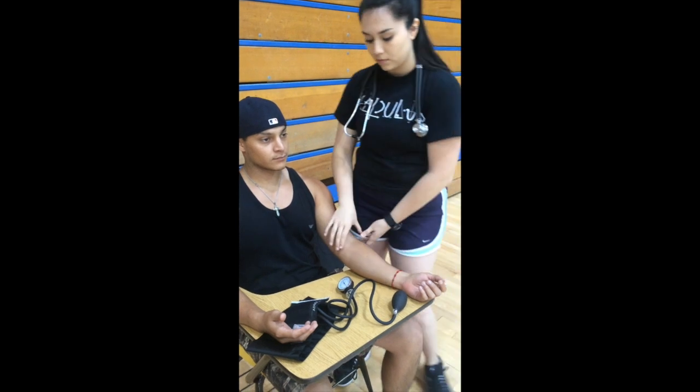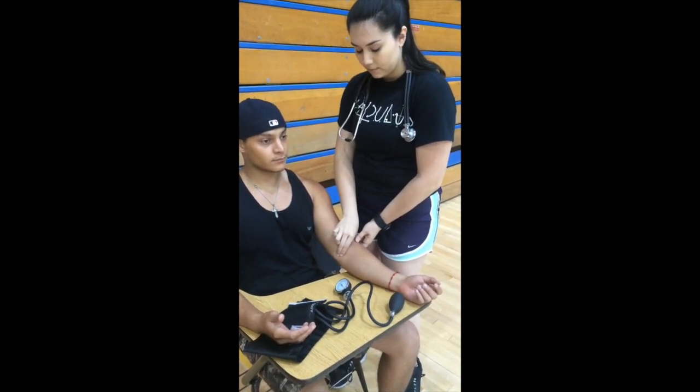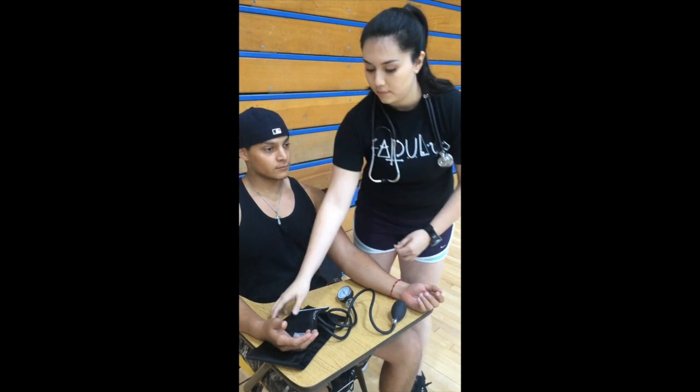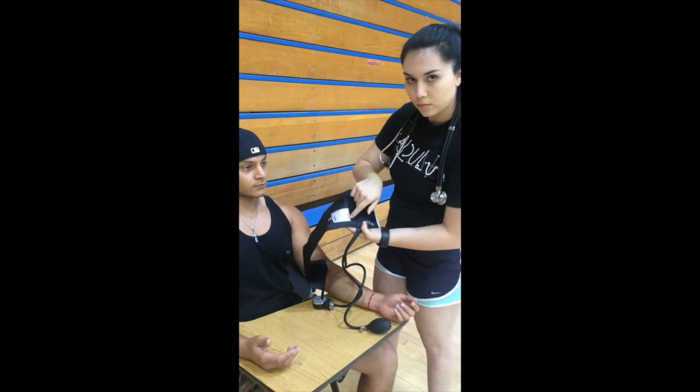Next, you will be feeling for their brachial artery while making sure you can feel the client's pulse. Then you are going to line up the artery arrow that is on the cuff with the client's brachial artery.